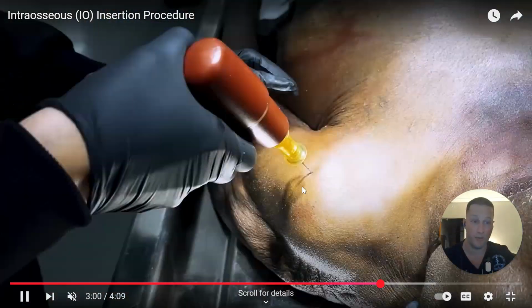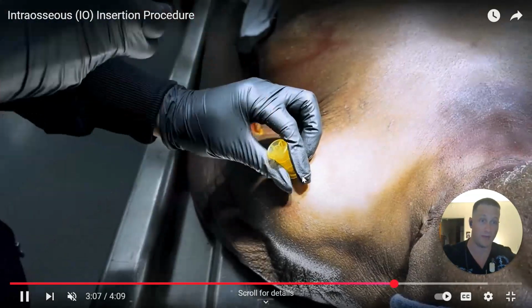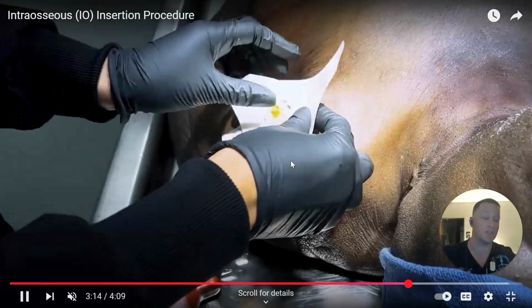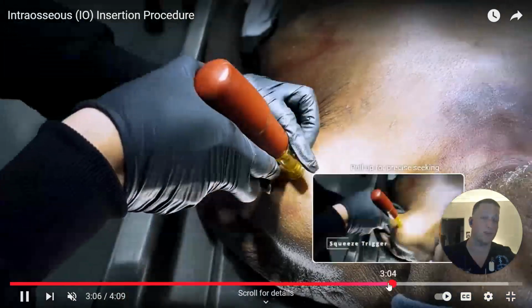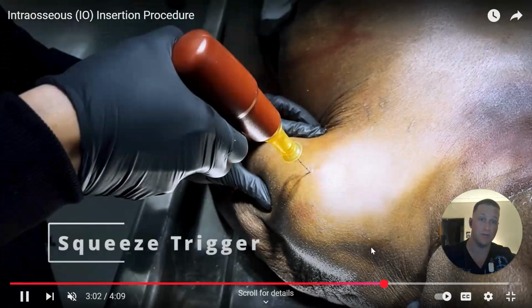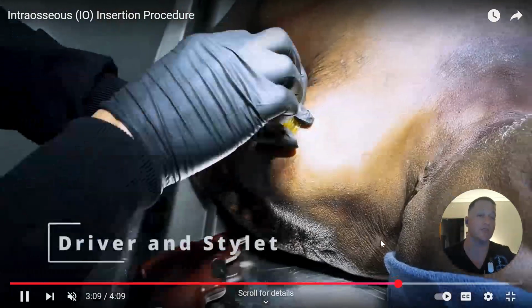The problem with that is if you're doing that on a baby, they went way deep on that one too. Watch out for that, right? Because if you're doing that in the proximal tibia on an infant, on a combat trauma infant, and they got injured extremities or whatever, and you just gun right through it, you're going to go right through their tibia, fracture their tibia, and your access is blown. And so just watch that. Stop right there. So they went a little too much. Stop. They kind of kept going. They went another 2 centimeters maybe. You want to stop as soon as it goes through that cortex.